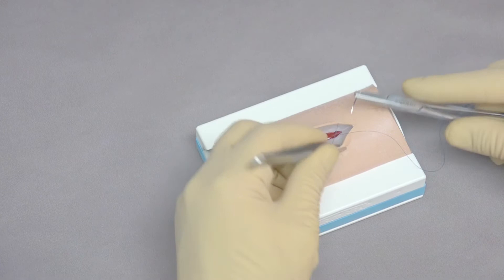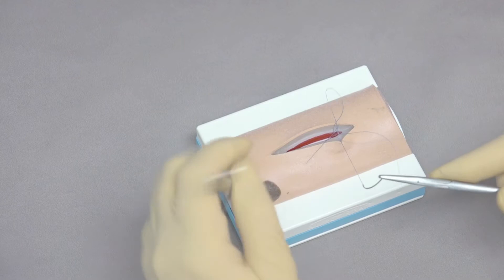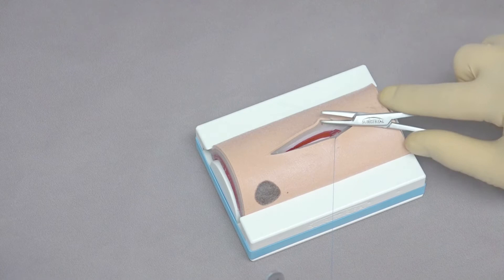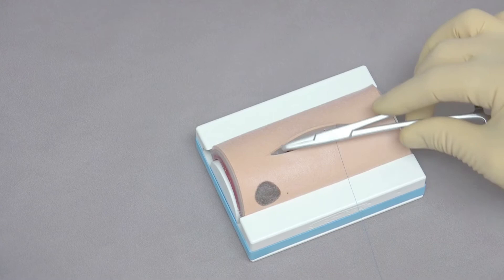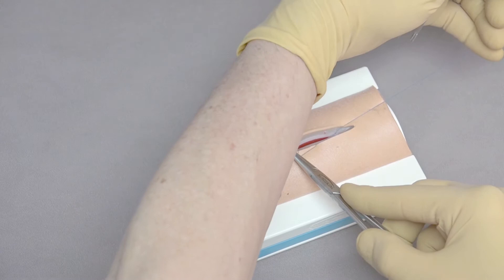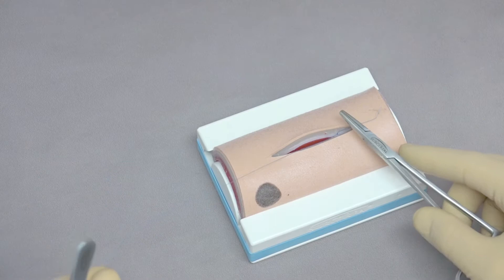On the near side, place the needle holders at the muscle, then move the subcutaneous tissue back so that when we place the needle, we're getting mostly fascial layers. Make sure the short end of the suture is not going through the loop. To make a square knot, put the needle holders right in the middle of the suture line, come around once, grab the short end of the suture, and when tightening, tighten with the incision rather than across it. Put the needle holders in the middle, come around once, and tighten along the incision, keeping it nice and flat so you don't end up with a slip knot.